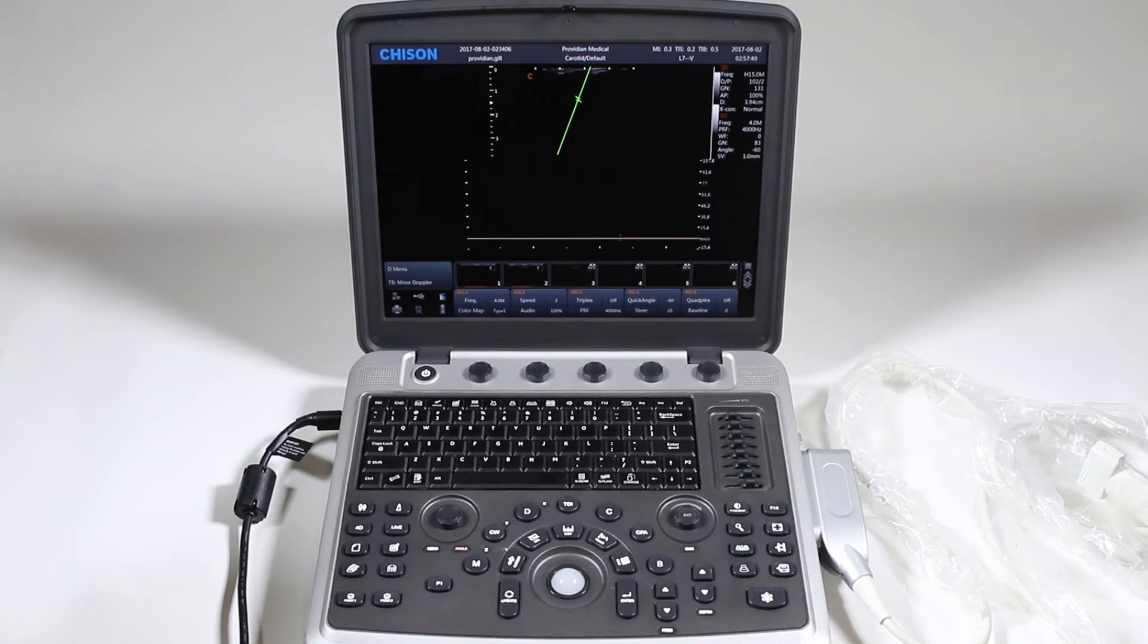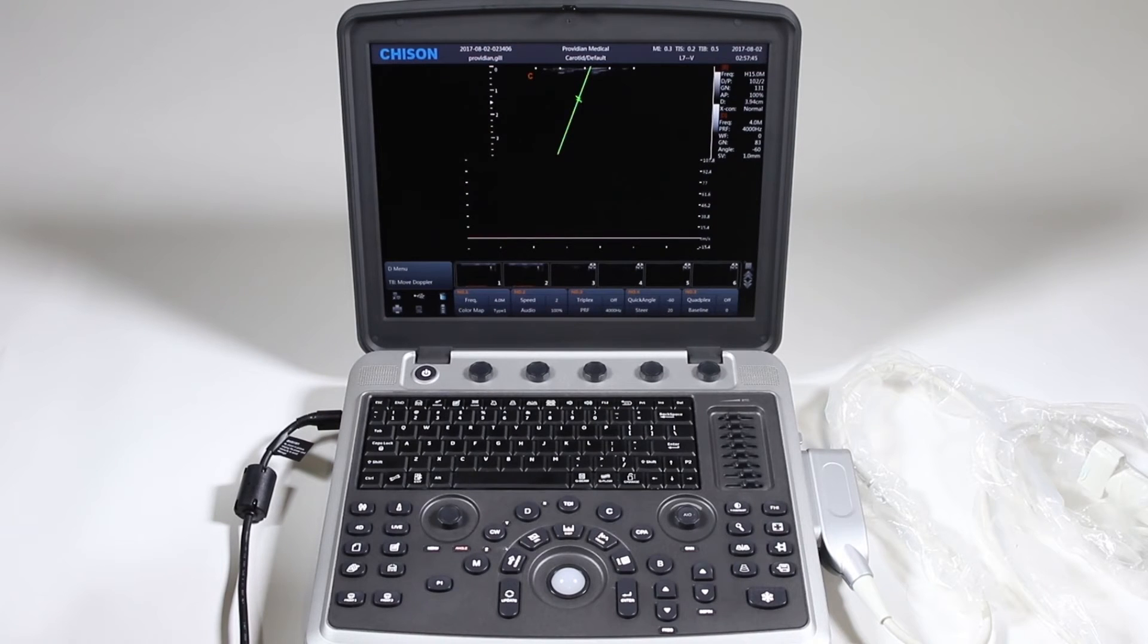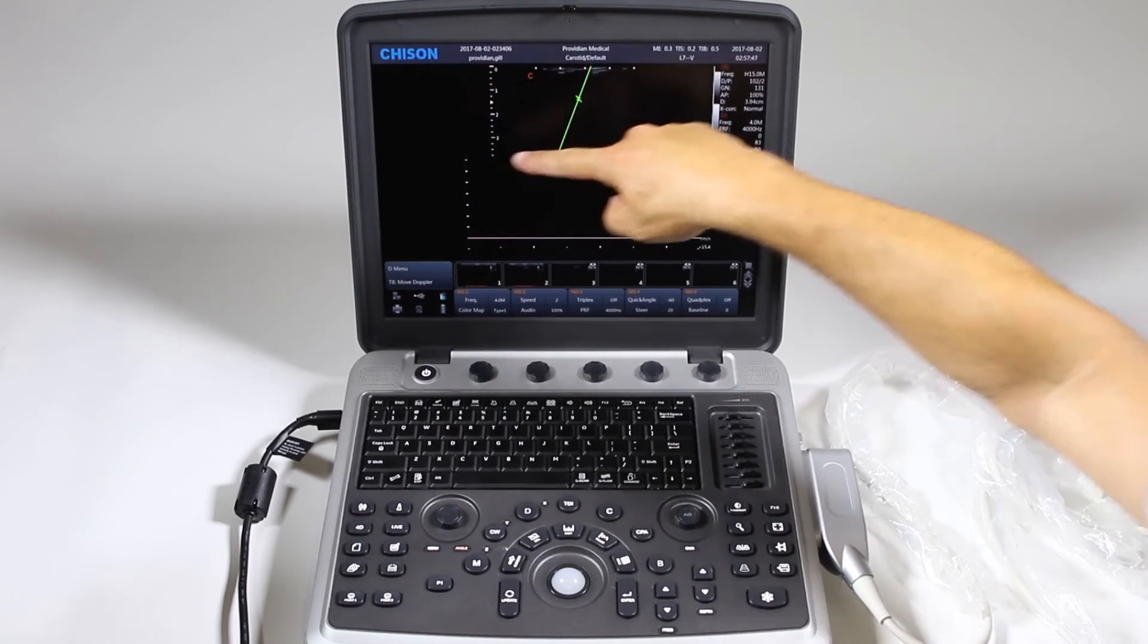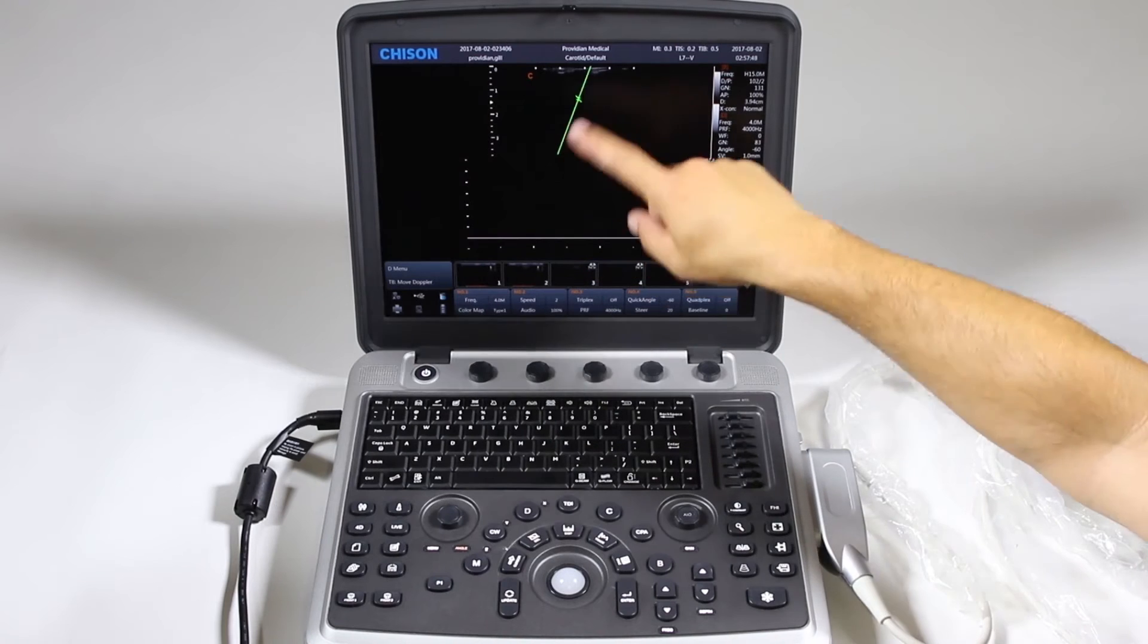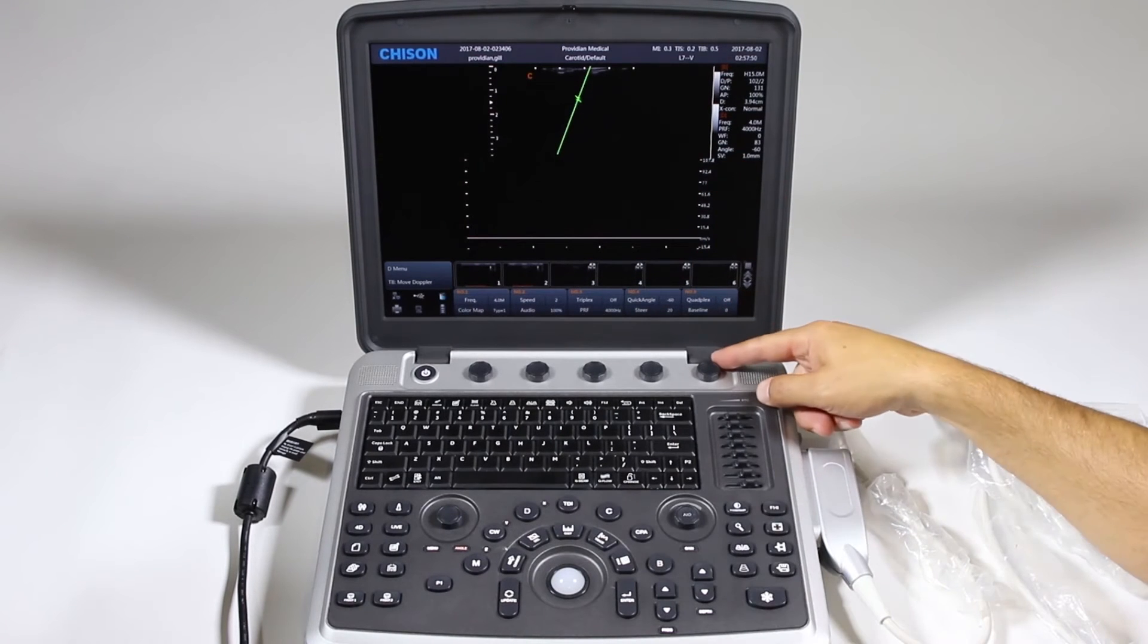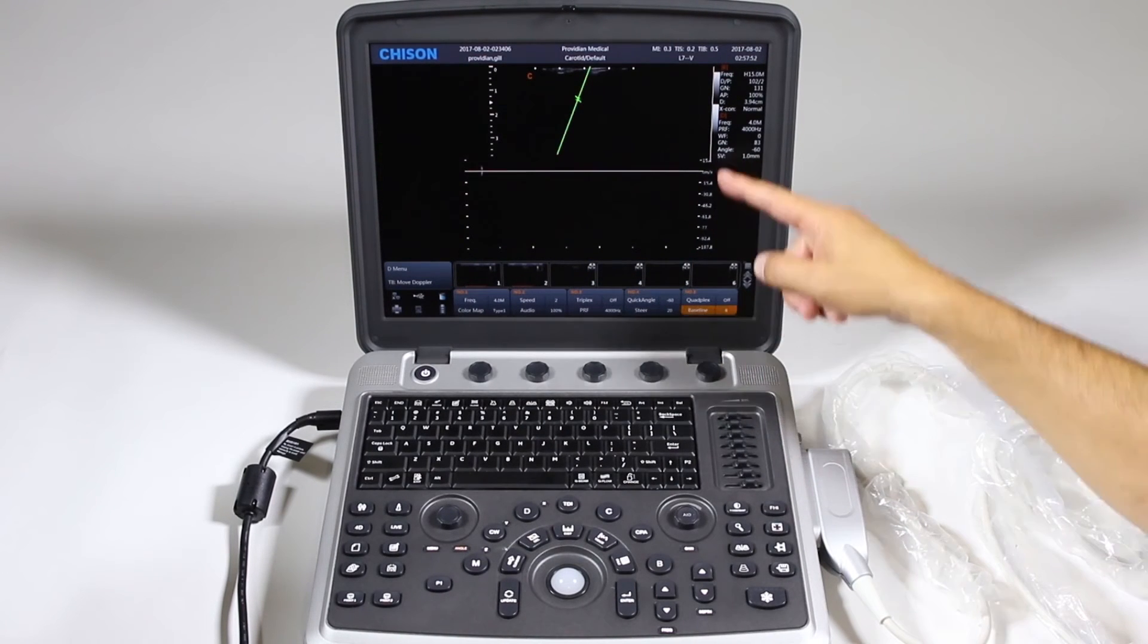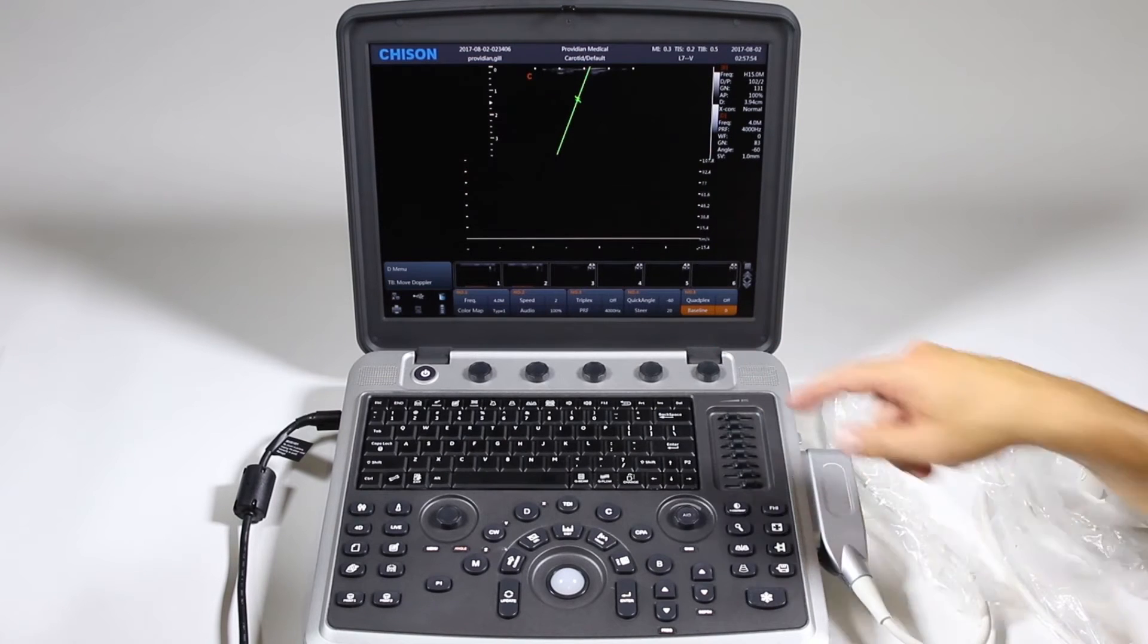Quadplex is like triplex mode except it also has live calculations going, so it will show you results right there live off of the spectral. And here also, twist to change the baseline and move that up and down.